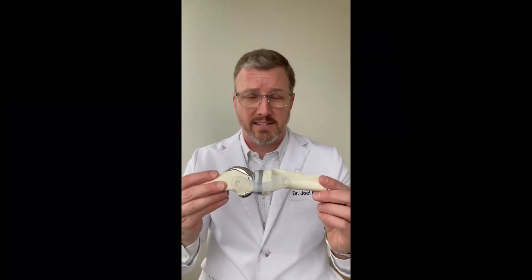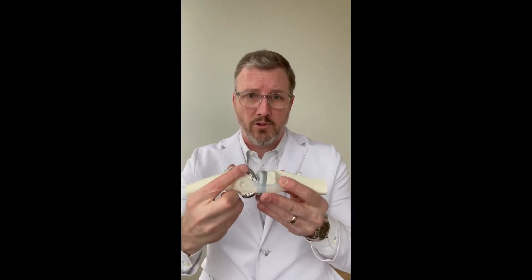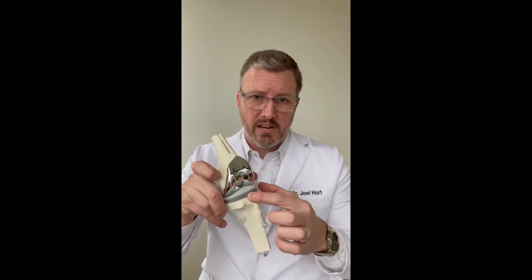When you do a knee replacement, you just have to understand the basics of it. This is a replacement model. You've got the femoral side, you've got your tibia here, and you've got your polyethylene — a special plastic that goes in between. That's how all knee replacements are basically made.